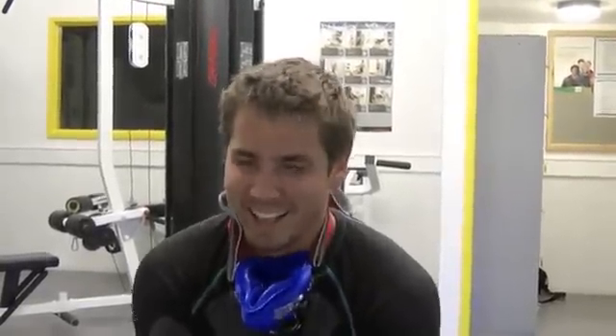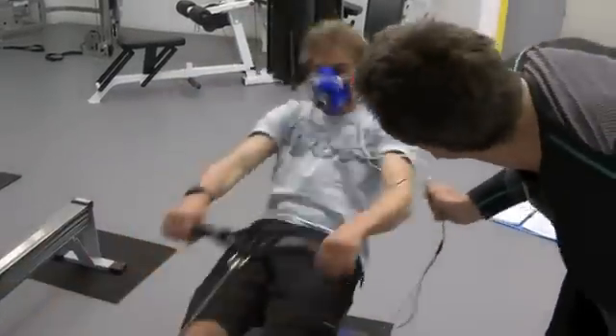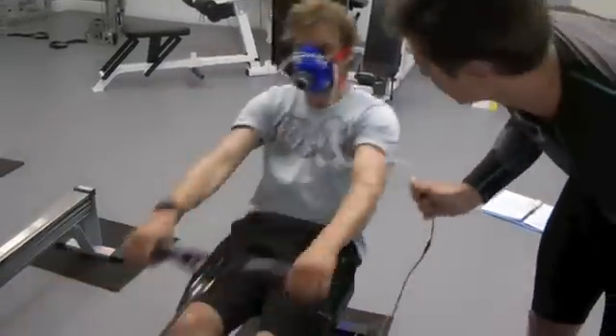Well done. In the last seconds... oh my god. Good, well done. Keep it going — last 10 seconds. Absolutely push it.